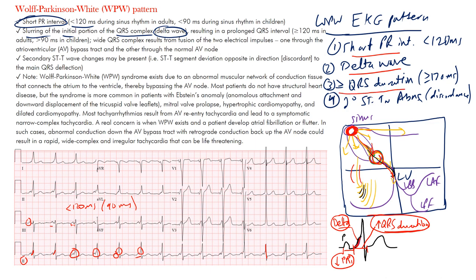The main features are: short PR interval, delta wave, and QRS duration that tends to be at least 120 milliseconds. Regarding ST-T wave abnormalities and discordance: the main QRS deflection is mostly negative here, going downward, and then you have ST elevation and an upright T-wave — going in the opposite direction. That's what we mean by discordance: negative QRS and then positive ST-T. Not always seen, but something to keep in mind.